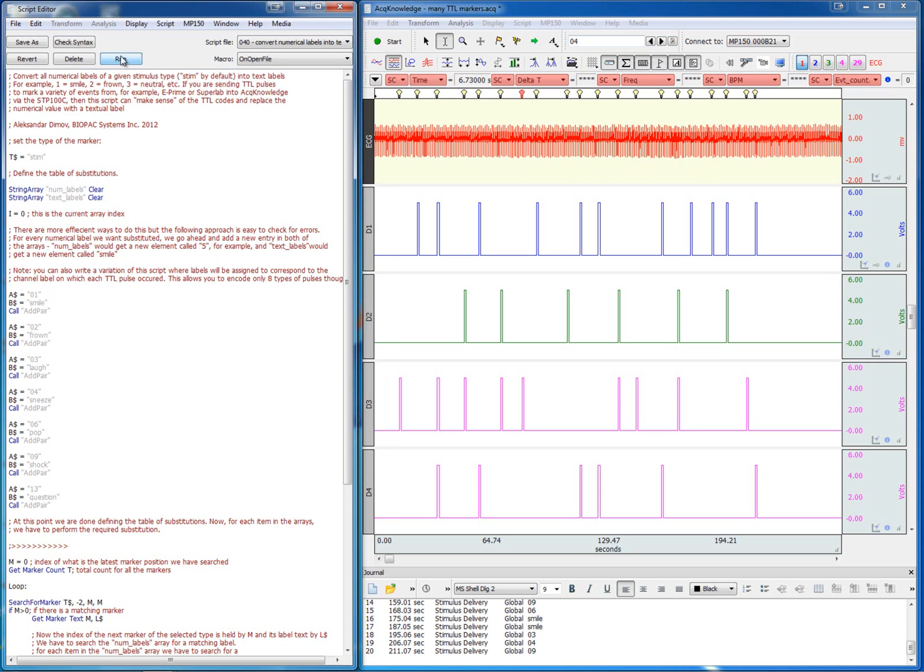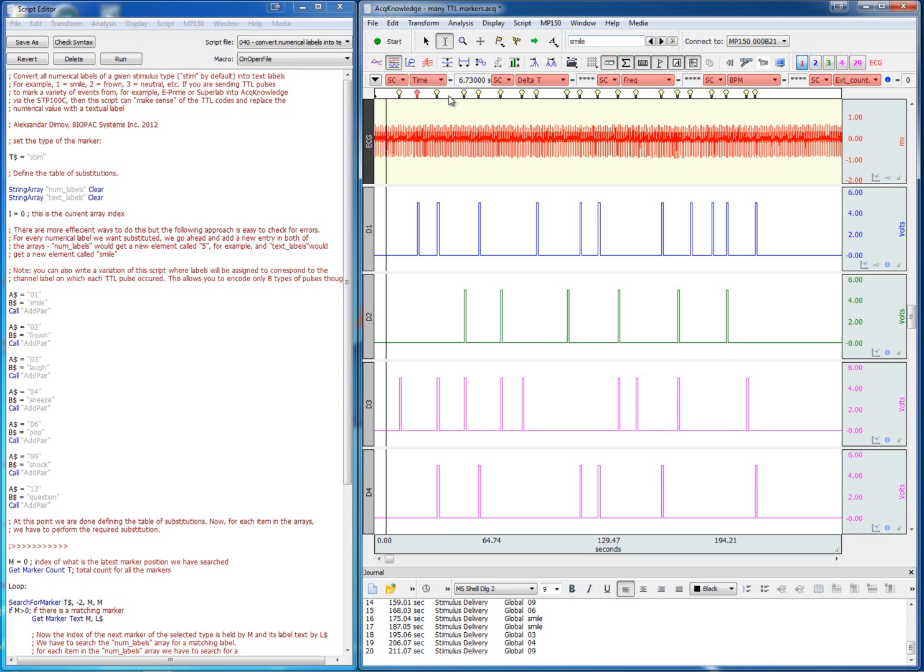Let's run the script. We can see that now all of these markers were automatically replaced by textual labels.